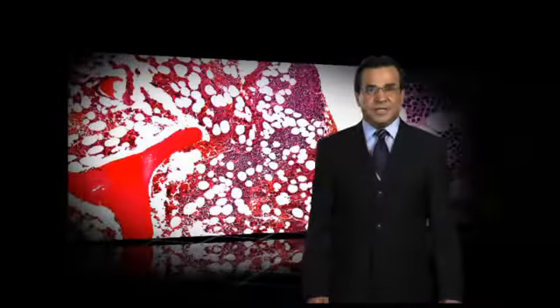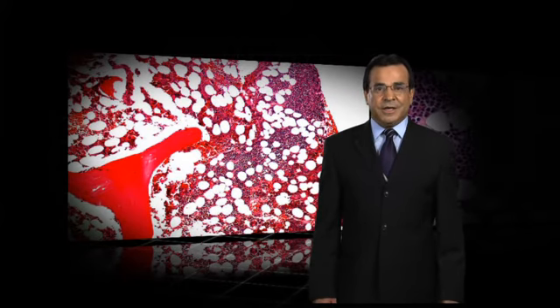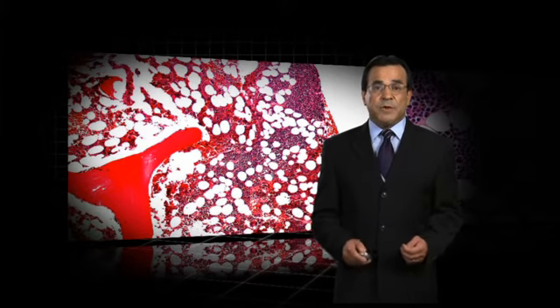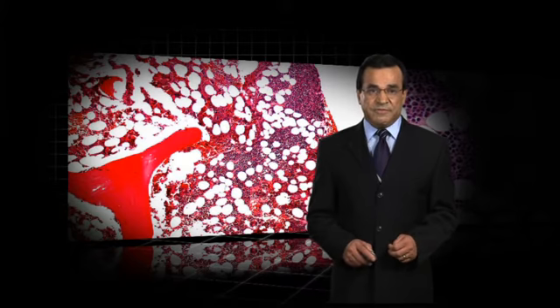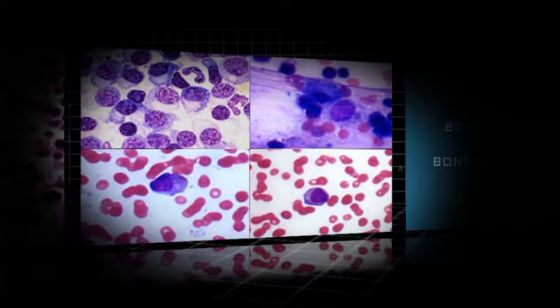The patient's initial presentation was with a bone marrow showing nodular involvement, but the bone marrow aspirate showed only 8.5%. This is a section from the bone marrow, and it showed this nodular involvement, with only patches of plasma cells. As we see here, it's solid sheets of plasma cells, and they are mature, meaning they are very similar to the normal mature plasma cells.